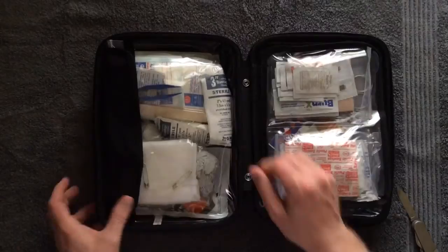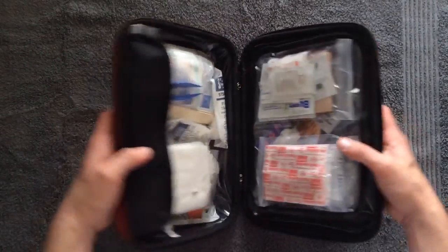It's a nice case with a double zipper — I like the double zipper. It feels sturdy and well made.